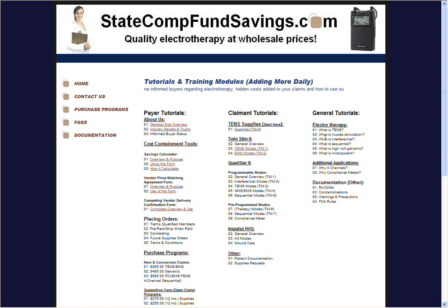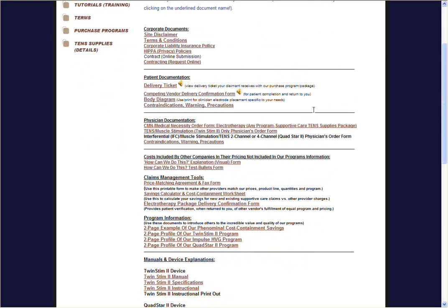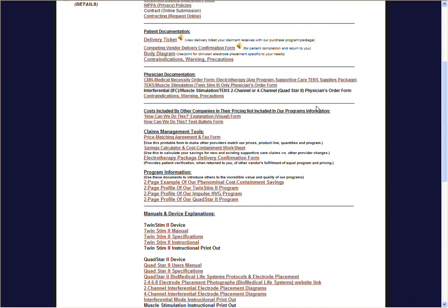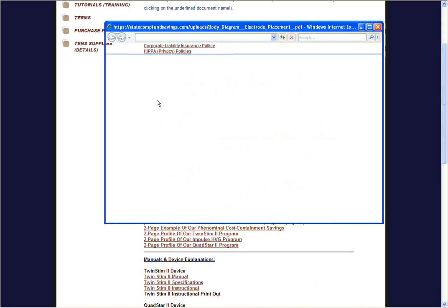But we'll start off with going over to the documentation page. Some of this is also covered in the TENS tutorial if you might have taken that first. But we're going to start with electrode placement. You're going to be more specific about electrode placement because you're trying to contract individual muscles, which are going to be specifically determined by your treating physician or clinician. So what you're going to want to do with this device is click in the documentation, under patient documentation, the body diagram. And that'll pop up.